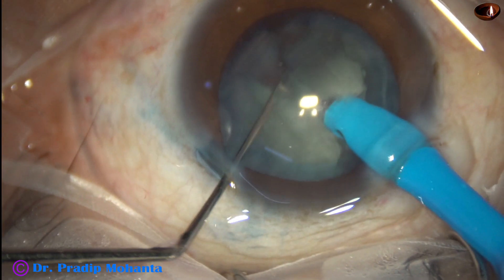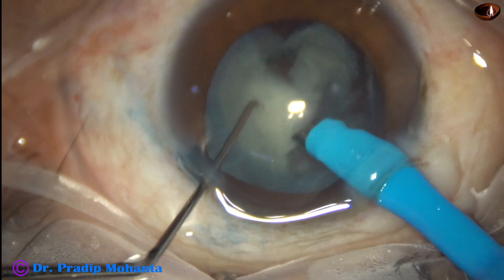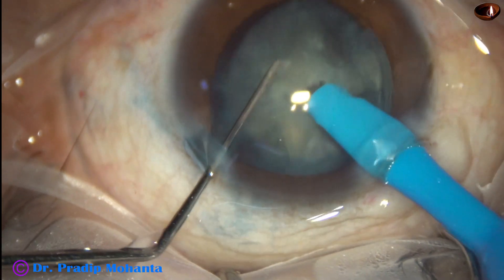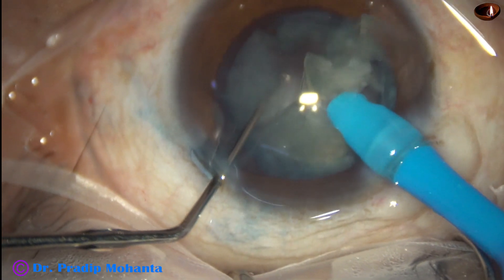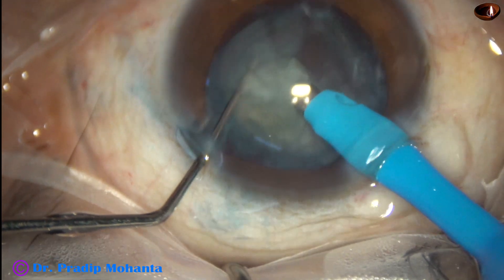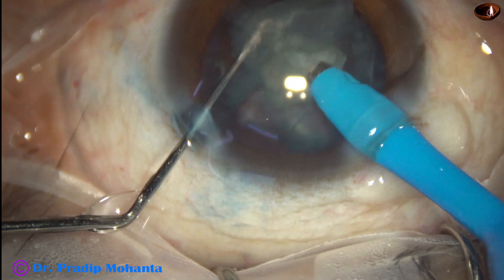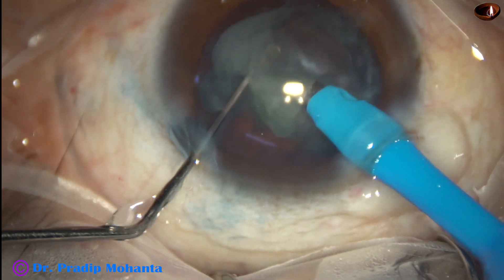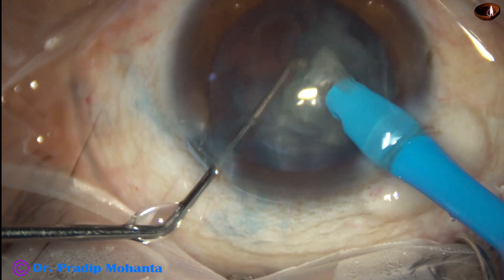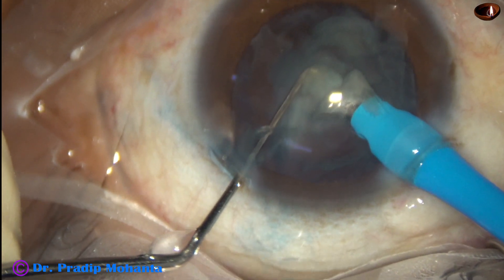This is a totally unedited recording and you are not missing anything. The lower pieces are subdivided into smaller pieces and they are emulsified. Ultrasonic energy is 70 percent. Flow rate is 47 ml per minute and vacuum is 470 millimeters of mercury.